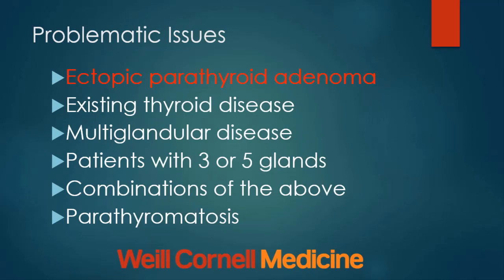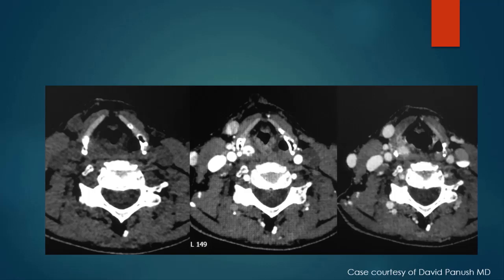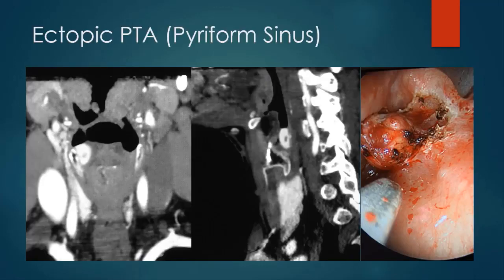Some problematic issues in parathyroid imaging. Let's start with ectopic parathyroid tissue. This case, loaned to me by Dr. David Panush, shows another ectopic parathyroid adenoma. On the initial 4D CT examination, there is an enhancing lesion at the apex of the piriform sinus, demonstrating typical washout on the delayed exam. On reformatted sagittal images, the lesion sits down at the apex of the piriform sinus. This information was used by the surgeon to perform an endoscopic procedure and mobilize the lesion from the apex of the piriform sinus.